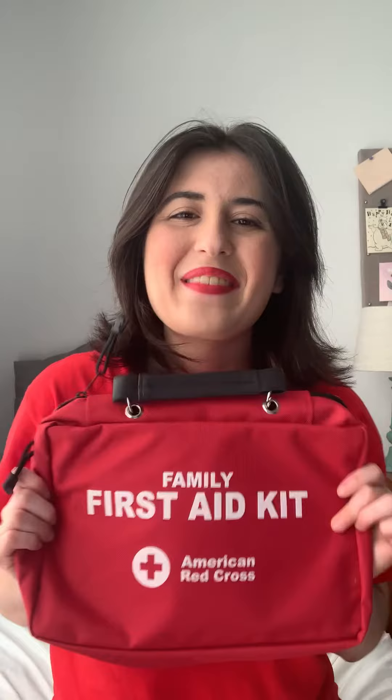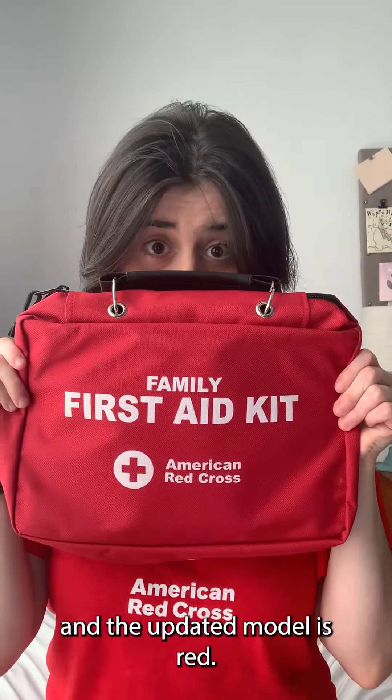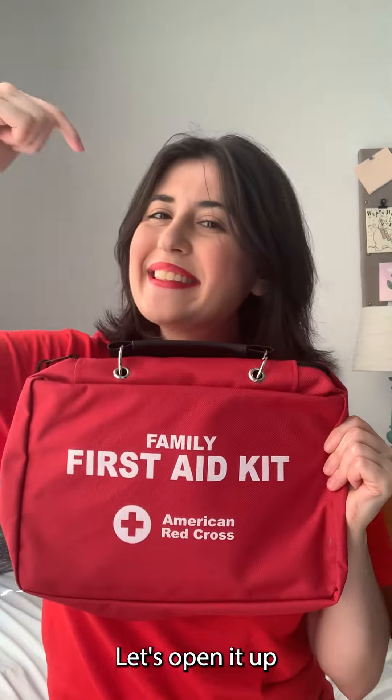That's right — it's a first aid kit from the American Red Cross. As you can see, the kit is super sleek and the updated model is red, so you can wear it after Labor Day. Let's open it up and see what's inside.